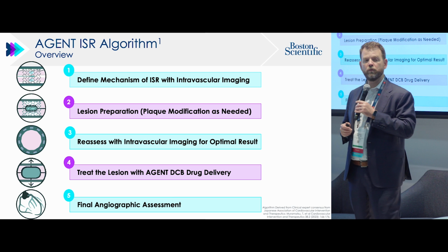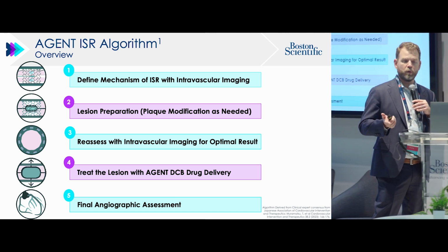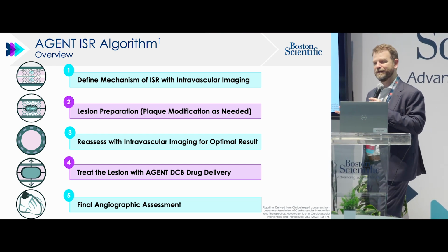Then we treat our lesion with the AGENT balloon, again one-to-one size, somewhere around 60 to 120 seconds, depending on data that's continuing to come out. Longer may be a little bit better, but again, it's a little bit patient and lesion specific.